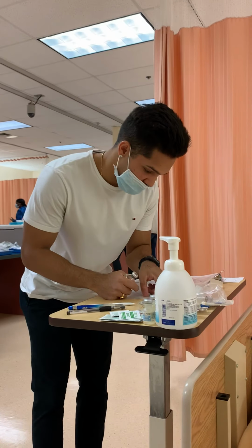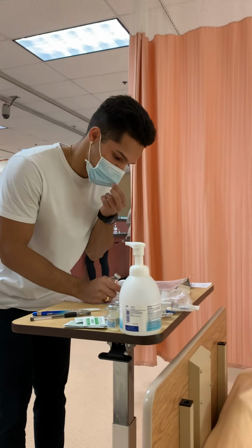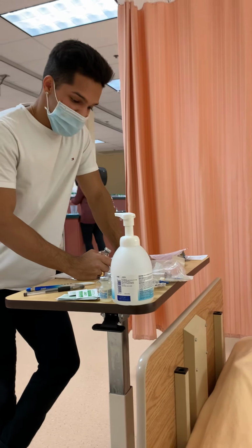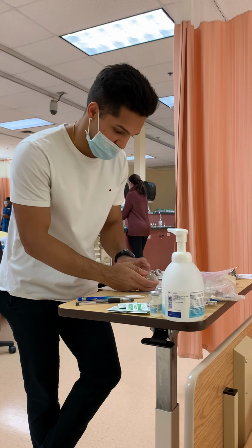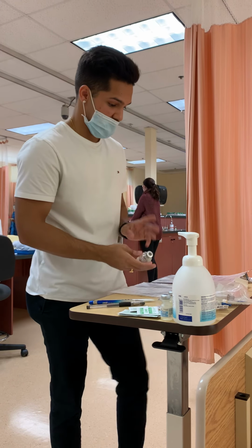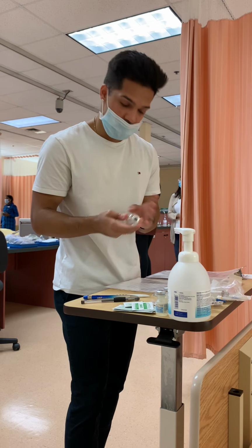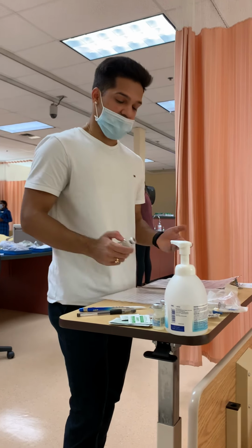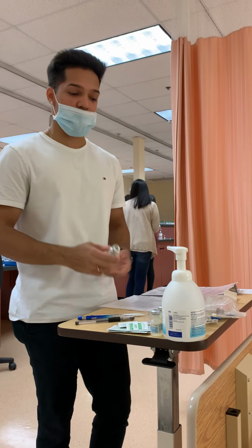This is for Ms. Wrightson, and her FIN is 1, 2, 3, 4, 5, 6, 7, 8, 9. Her date of birth is October 20, 1999. She has no known allergies. The medication we're giving is cloxacillin, dose is 1 gram. This is a 2 gram vial, so I can withdraw the dose from this vial. The route is IV. This is IV infusion only, and the frequency of this medication is every 6 hours. Not given yet, signed off for October 20th at 0600, so I will be giving it.